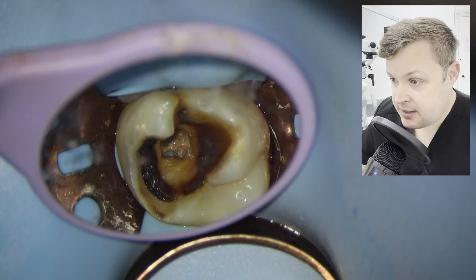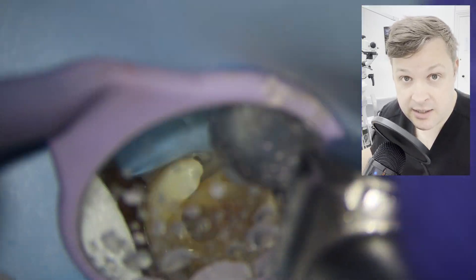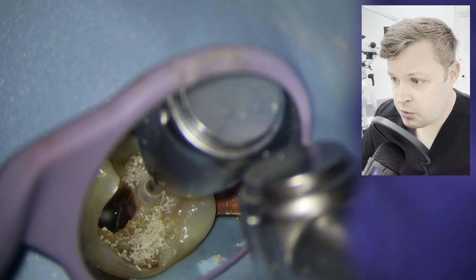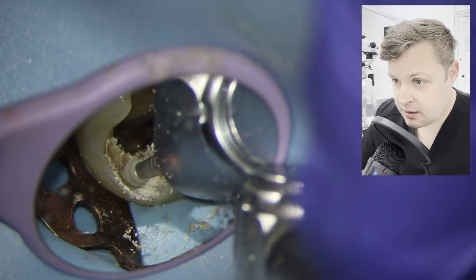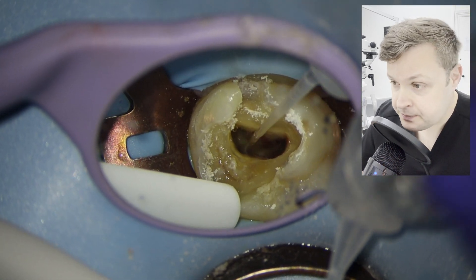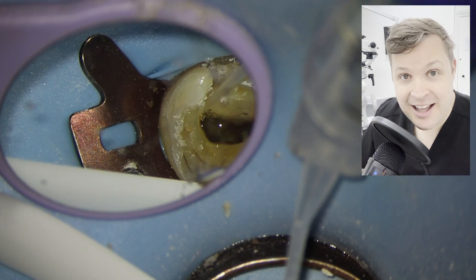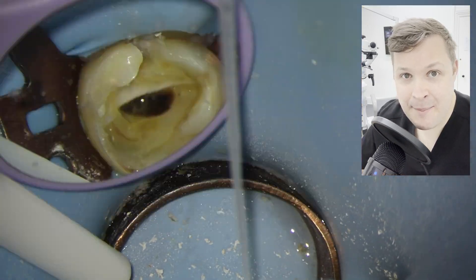This patient presents with a temporary dressing. The GIC looks like it's come out, or whatever temporary dressing was in. There was a lot of decay and a hell of a lot of dirt and mud that just had to be removed. It's really, really important to remove all of the filling material and all of the decay at this stage — mainly because when you are halfway through the root canal and you've opened up and shaped the canals, if you then decide to remove the filling and decay, little fragments will fall down the canal spaces and block them.